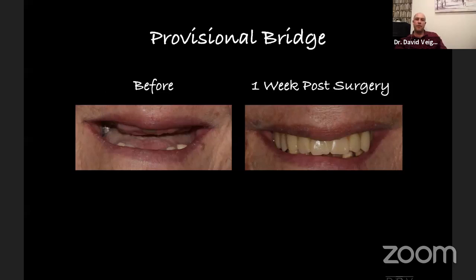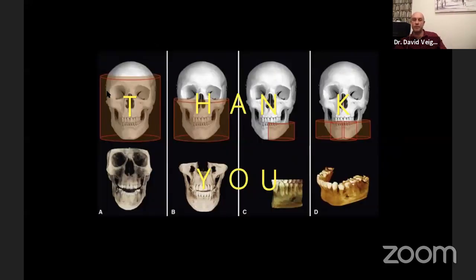Okay, and there's the before, and then that's the 1 week post-op. It's an interesting case, this one, because you can see there's a little bit of a midline shift to the patient's left. When we look back at it, I don't have the photo because the patient didn't want me to use her head photo, but the prosthodontic planning at the beginning didn't have the midline correct. So I followed the prosthodontic planning and it actually had the midline discrepancy. I just followed that thinking that was the right position.